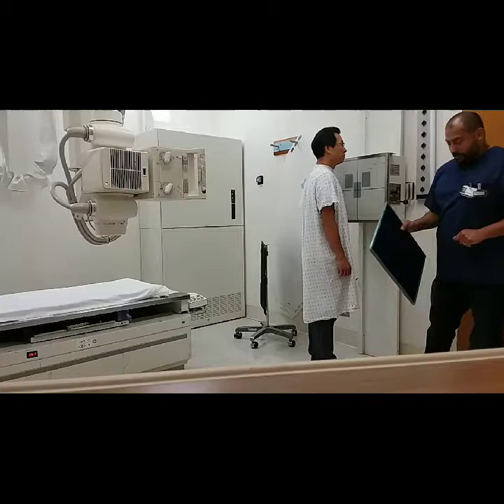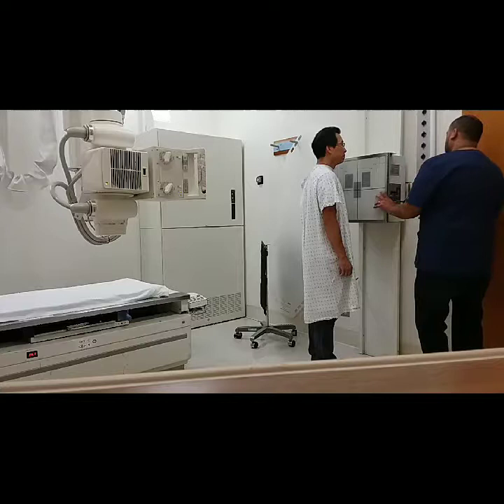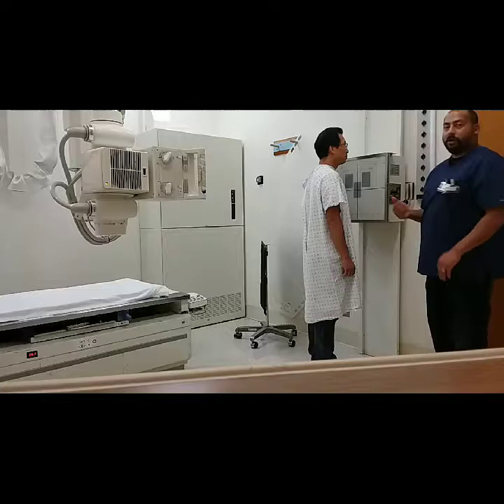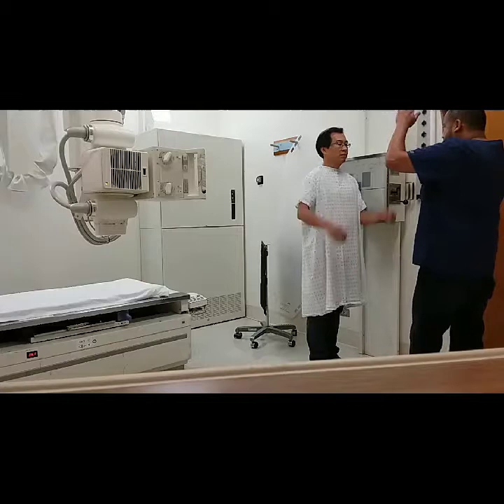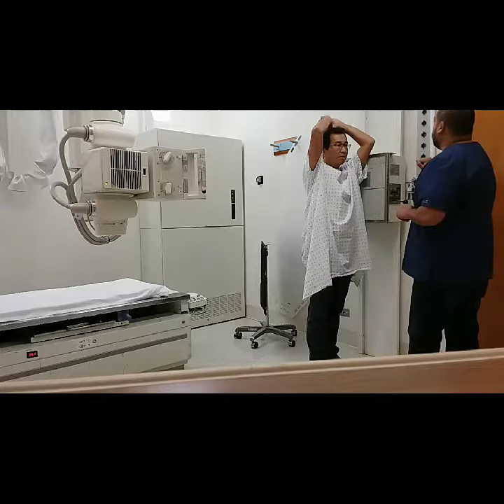Now that the PA image is running, I can set up our next image — the lateral. We're going to go portrait orientation. I'll have our patient face me, turn to the side, and place his left shoulder up against the IR. I want to see if he can get his arms up over his head; we have a pole available to assist if needed.